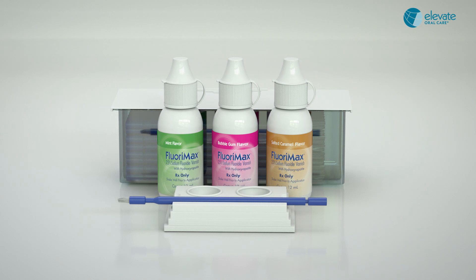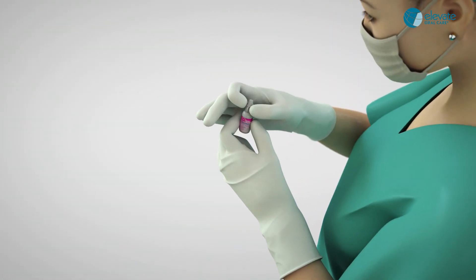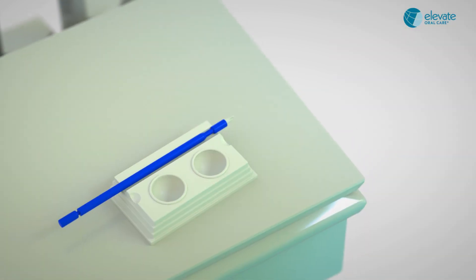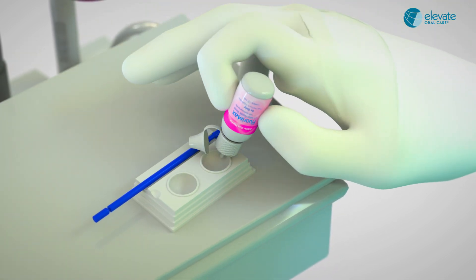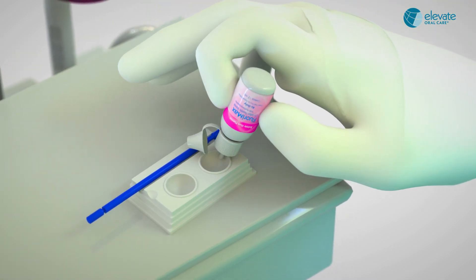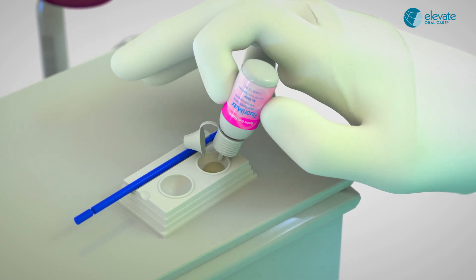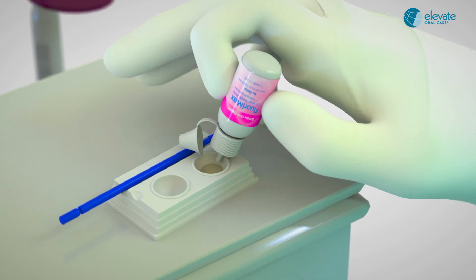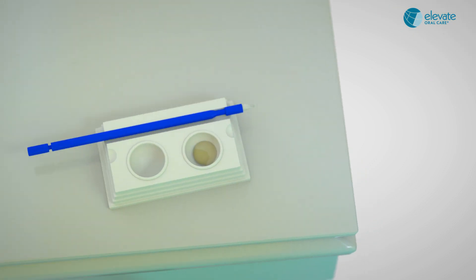Application of bottle system. Replace the storage cap with the dropper cap. Shake the bottle well for 10 to 15 seconds. Quickly invert the bottle and dispense product into the supplied dappen dish. One drop for pediatric patient or site-specific application, two drops for mixed dentition, and three drops for adults.